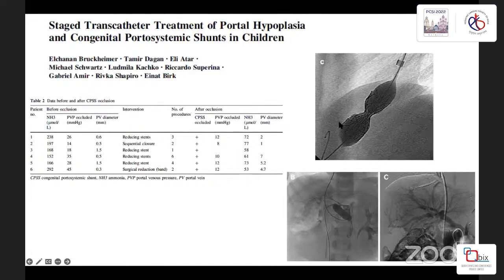He has done a strategic closure using the stent, which is downsizing the tract by actually suturing to the stent, and the diameter of the tract is getting downsized using multiple sutures in the stent, whatever the size, to lesser than 40% or so. So he demonstrated the portal veins; you can see before and after in some of the cases.